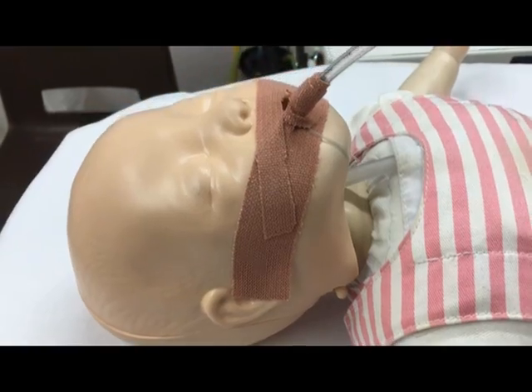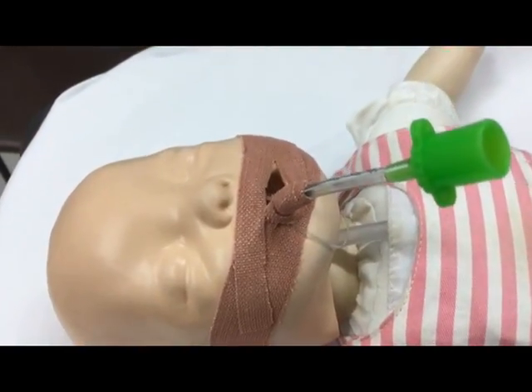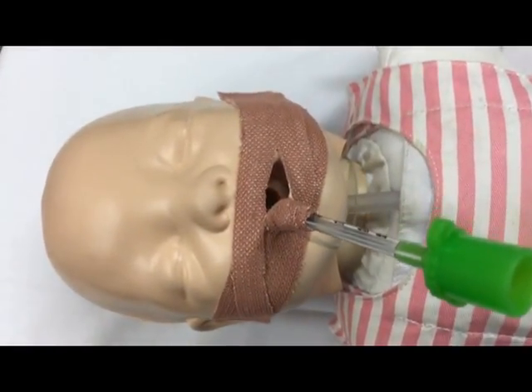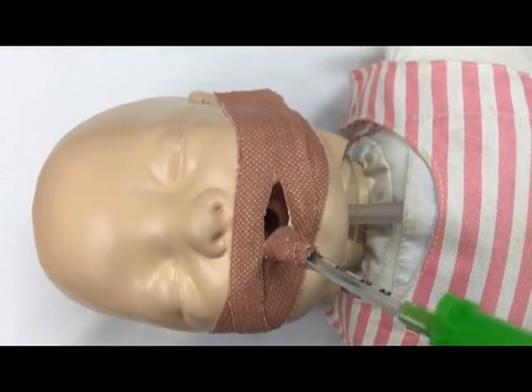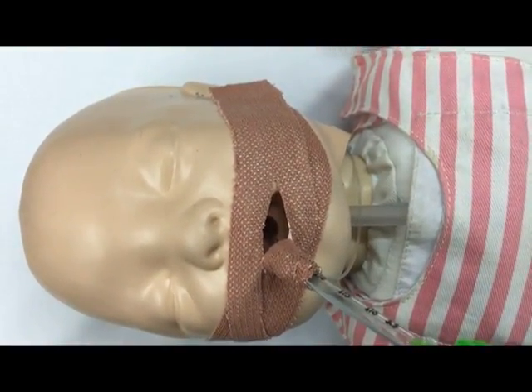In this short video, you can see the appropriate 3-point method of securing the endotracheal tube. There is an additional video available on the portfolio website for further information about this important skill.